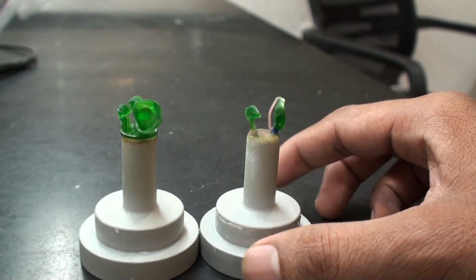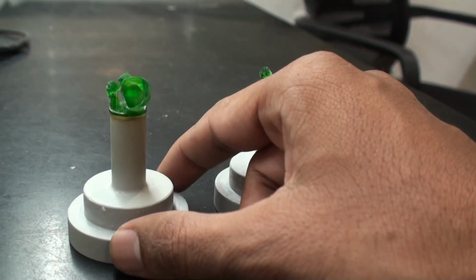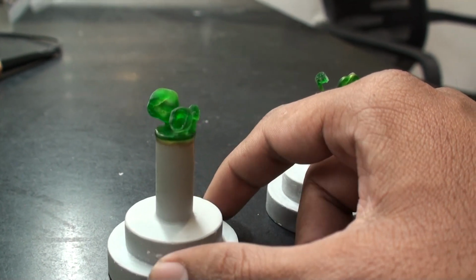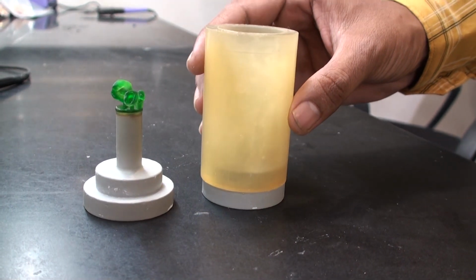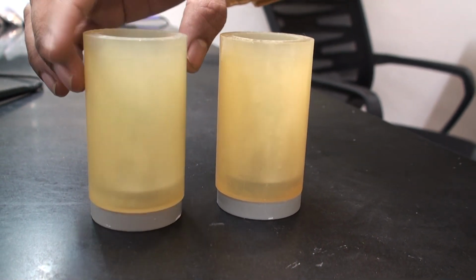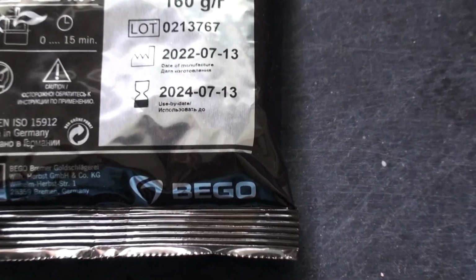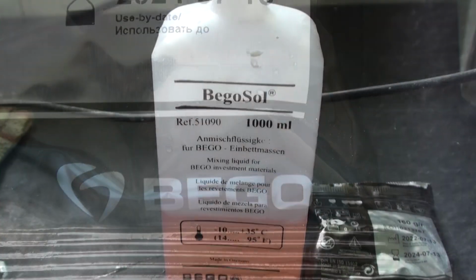So the wax pattern has had some sprues placed on them. The left ones are, I think, a crown, and the right side is, I think, a veneer. And so once it's all done, we put the rings around it and we start putting the investment material in it. So this is the investment material.